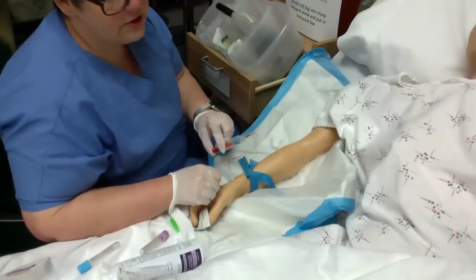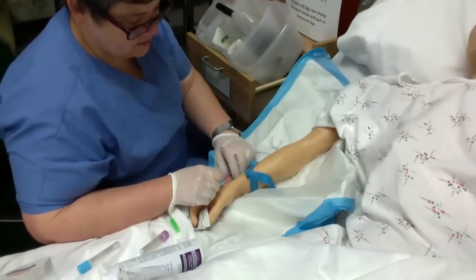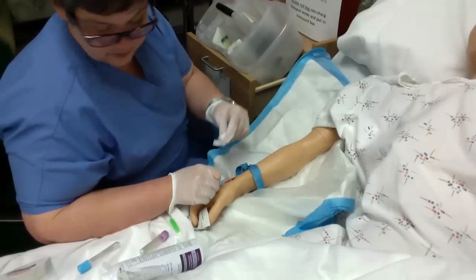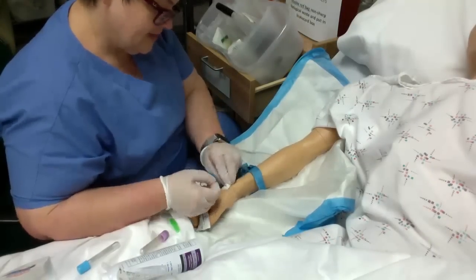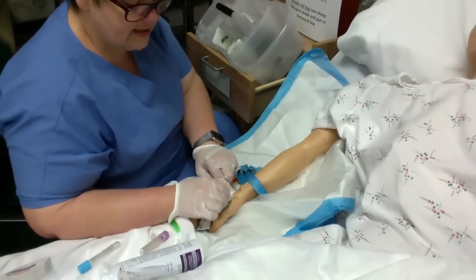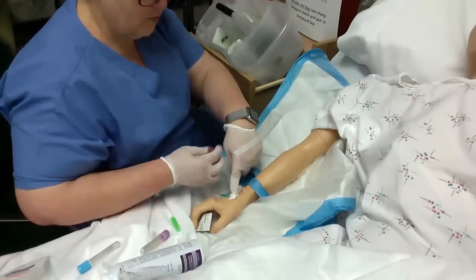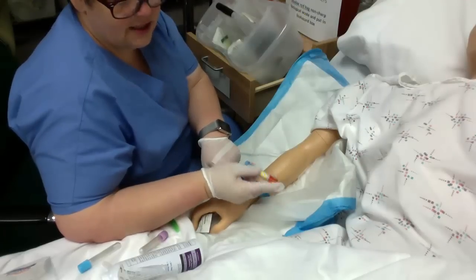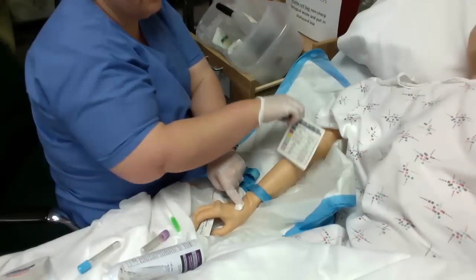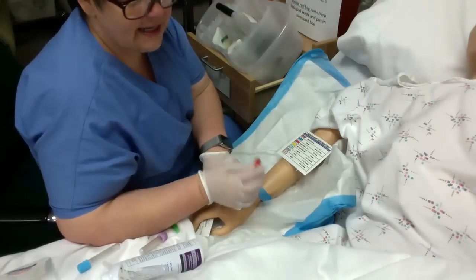When you're holding tension, you're always doing it below the path of the needle. Always pull the tube off before you remove the needle, and always drop the tourniquet before you remove the needle. Keep your fingers away from the sharp, then press it down — these are designed to be one-handed activators. On your tubes, you usually have a rock time to help mix the blood with the additives. This card shows you how many times to rock — this one is supposed to be eight to ten times.